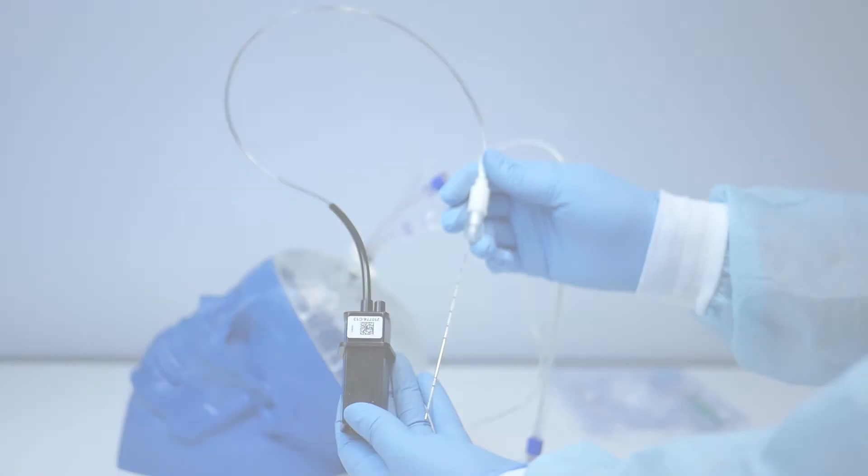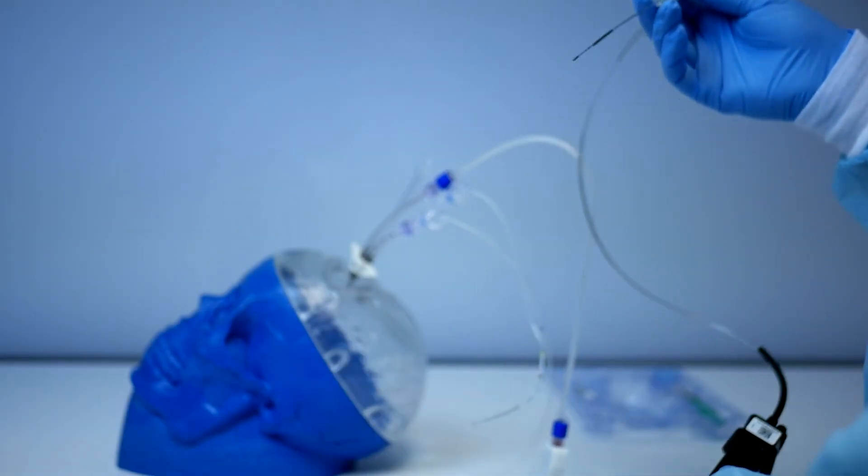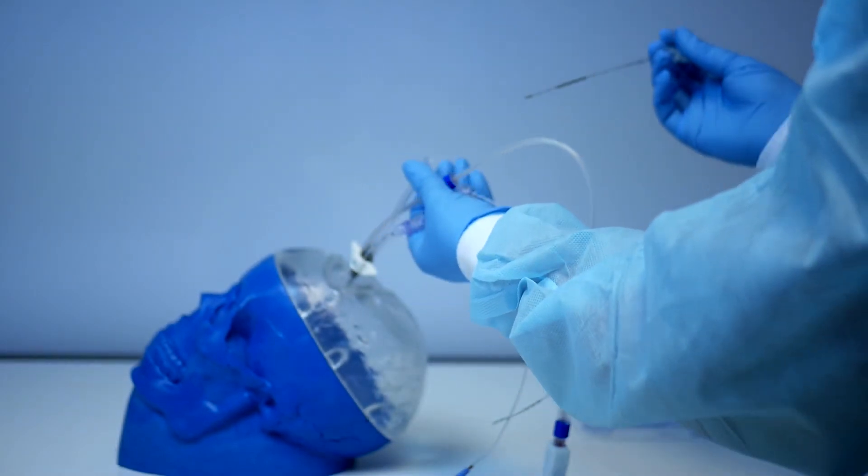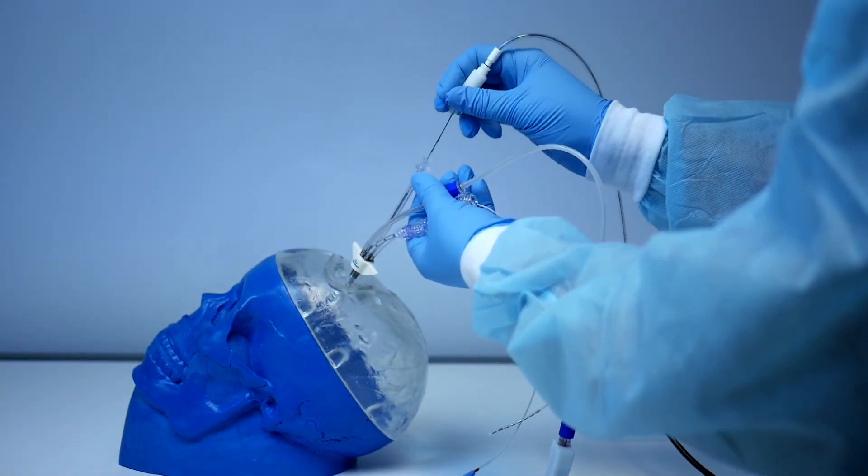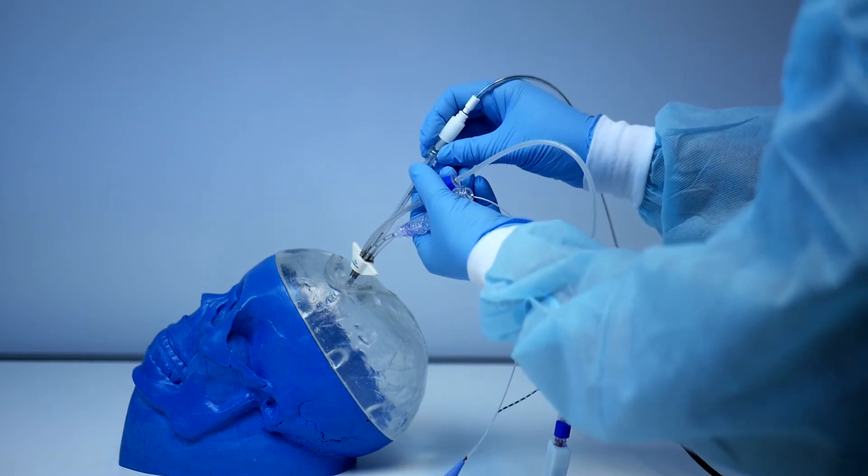The Integra Camino ICP probe does not require any additional components from the quadlumen bolt kit. Simply insert it through the large pigtail and turn the lure lock fitting clockwise to secure.